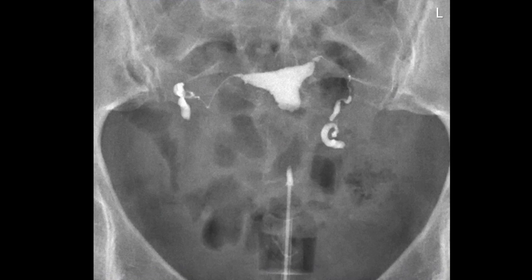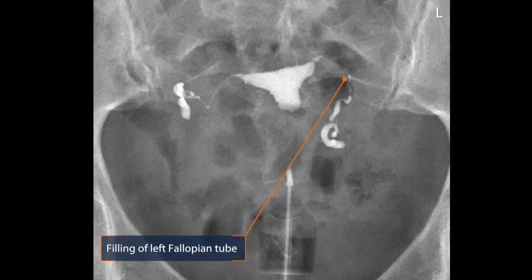Over here you can see the filling of the uterus. Over here the filling of the left fallopian tube. The first part of the tube is very thin — that is normal. And this is the filling of the last part, the last end of the fallopian tube. It is a little bit wider, and that is normal. That is because of the mucosal folds.